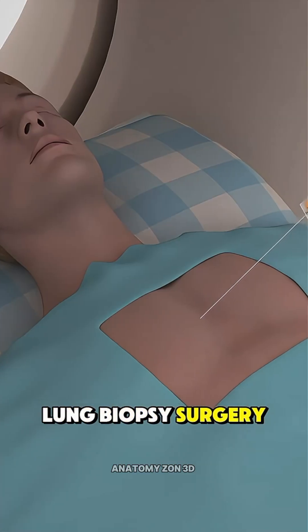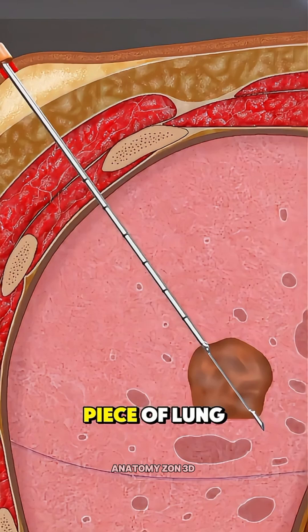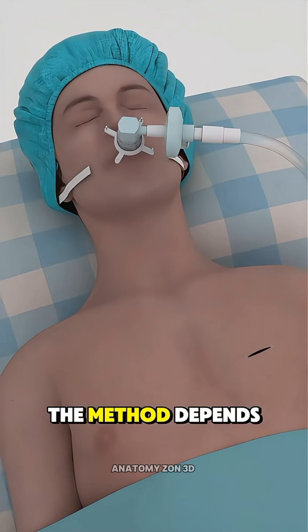Ever wondered how lung biopsy surgery is performed? A lung biopsy is done to collect a small piece of lung tissue so doctors can check for infections, inflammation, or cancer. The method depends on where the suspicious area is located.